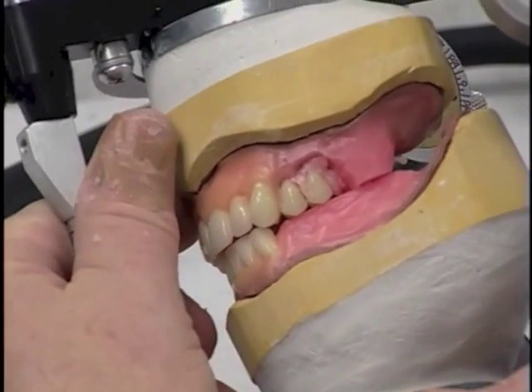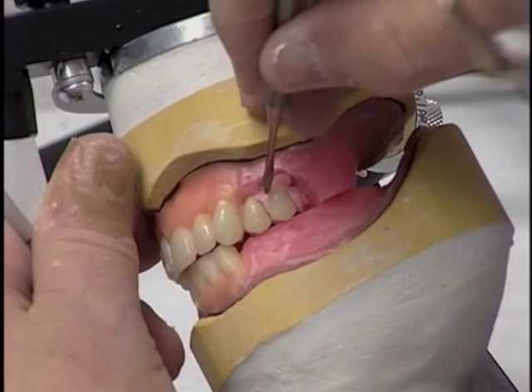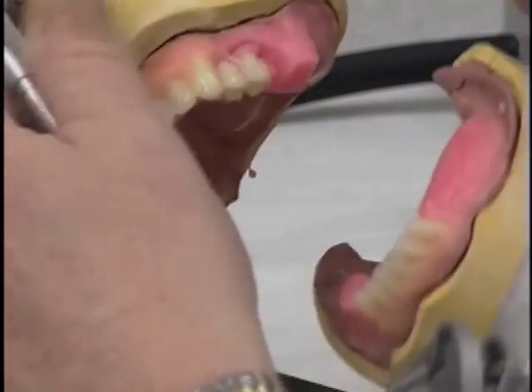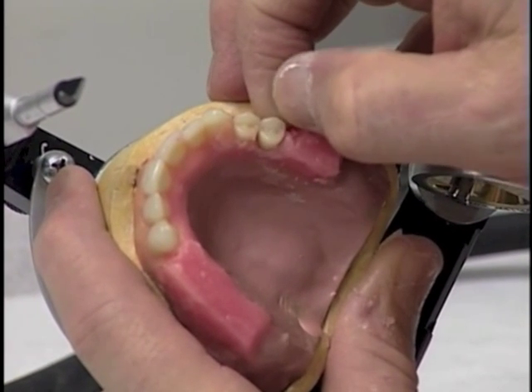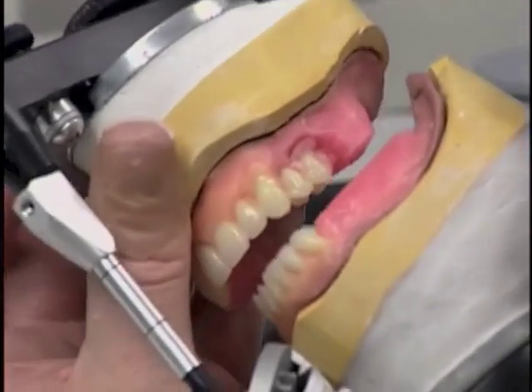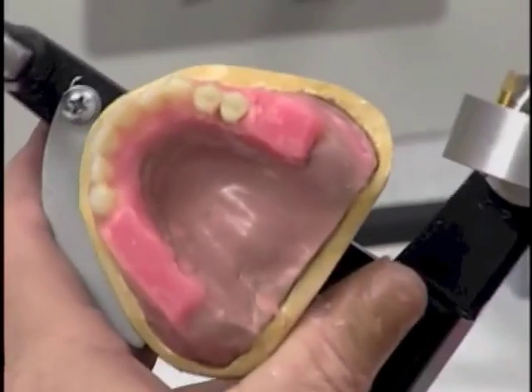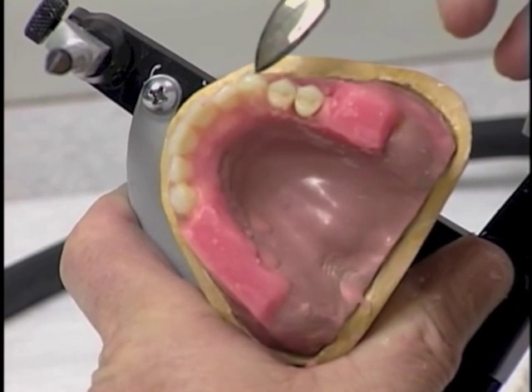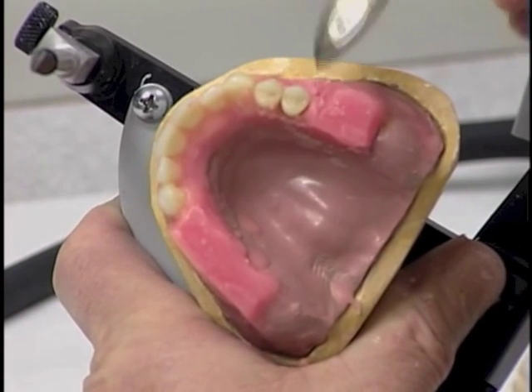When we look from the buccal now, we see that this tooth has just a slight distal inclination to it, so I'm just going to move it distally slightly and try to manipulate that lingual cusp to get it down just a little further than the buccal cusp, just slightly. About like that. Now from an occlusal aspect to see if the arch form is turning out right. And we see now that this tooth is falling in line with the arch form that we started with the anterior teeth and continuing through the premolar region.